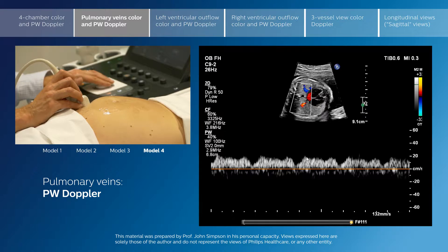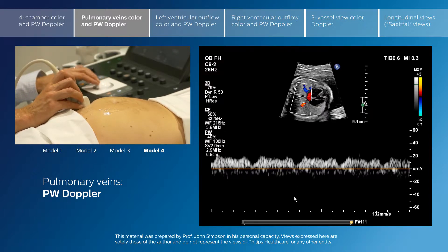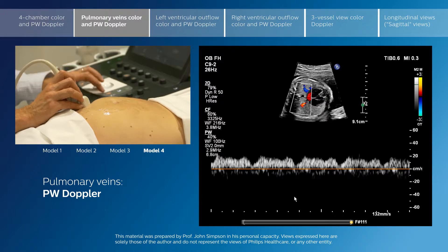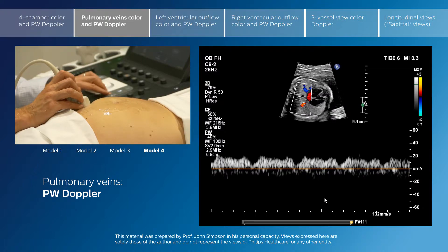This is used particularly to assess some fetuses with, for example, hypoplastic left heart, and it has important implications for postnatal management. But this is a normal, phasic pulmonary veins Doppler flow pattern.